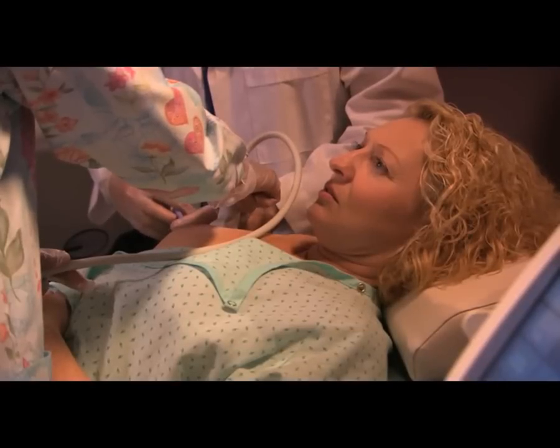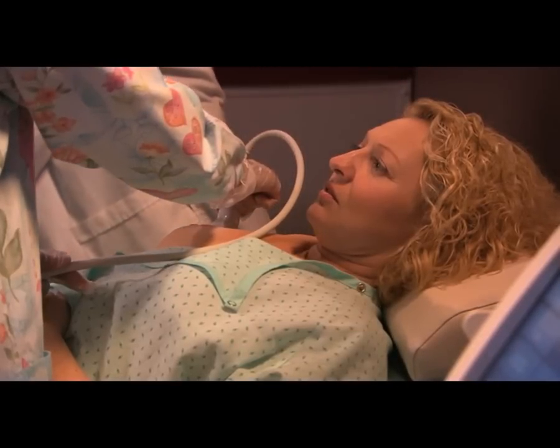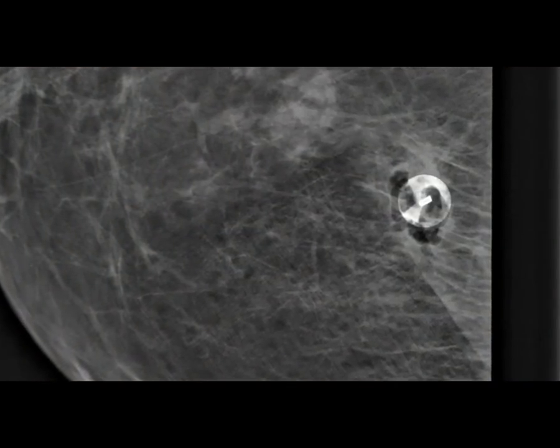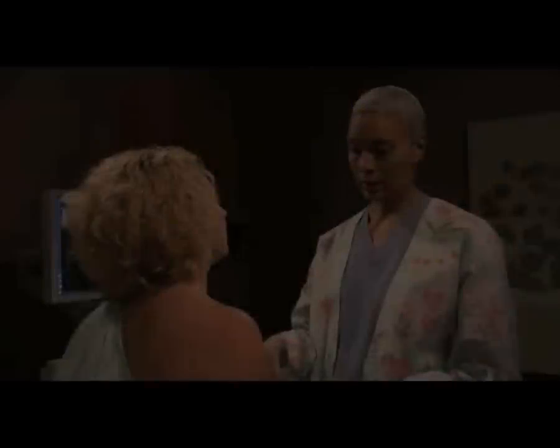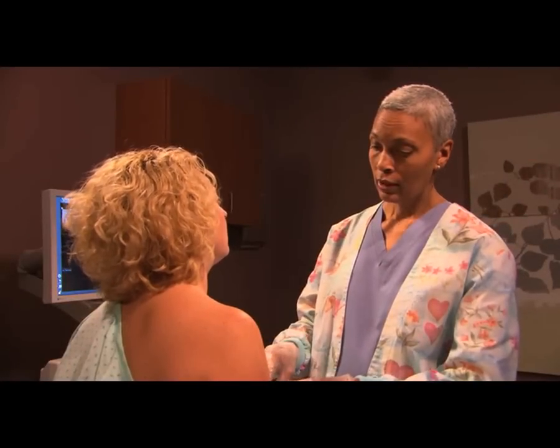Finally, a tiny marker is placed at the spot where they took the sample. This can be seen in future mammograms to show the location of this biopsy, and to minimize the chance that this location would be biopsied again. When the procedure is finished, they bandage your incision and apply pressure.